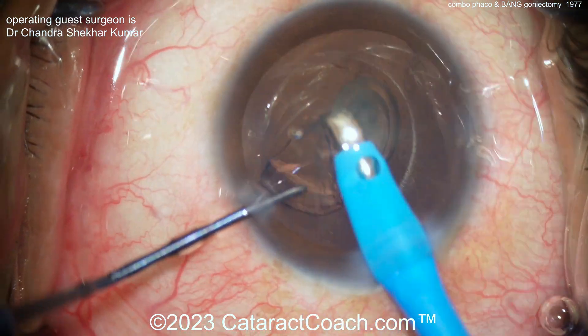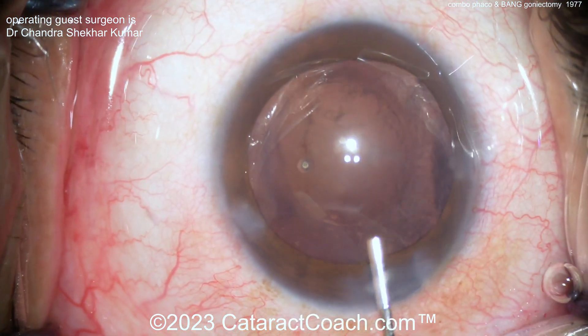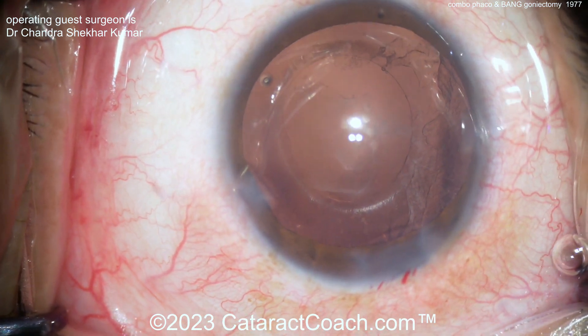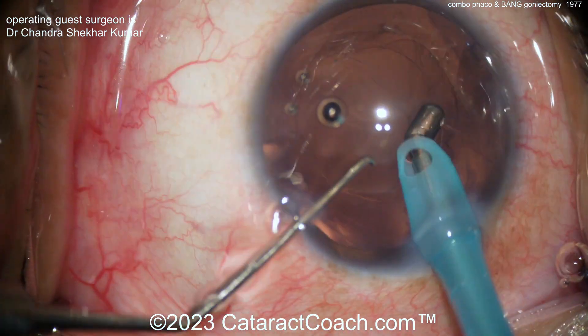Now BANG — B-A-N-G — is Bent Ab-internal Needle Goniectomy. You've seen the video here on CataractCoach from Arsham Shabani from Washington University in St. Louis, USA. He really goes through it step-by-step, shows you his studies, and it's actually a very effective procedure.